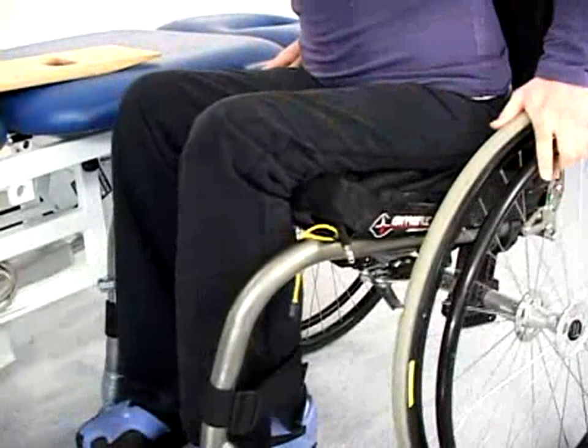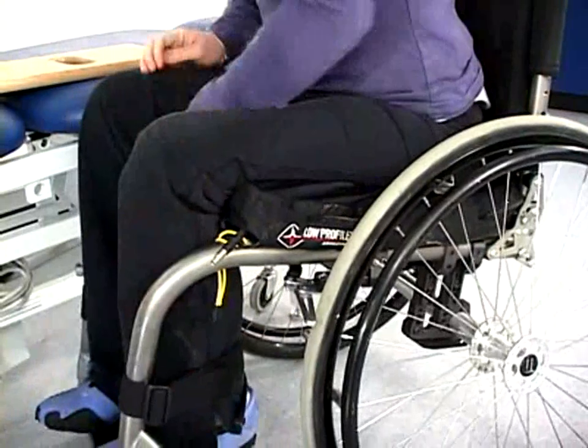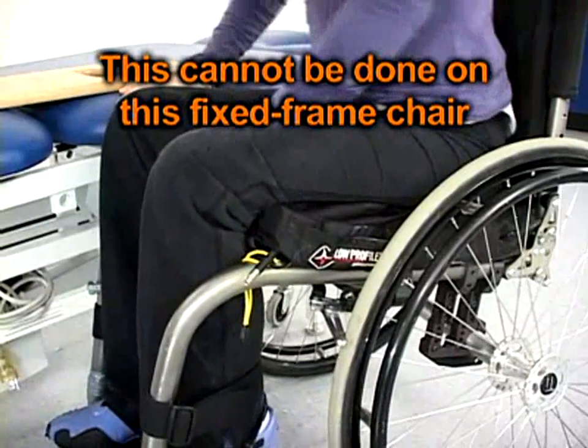To perform the sliding board transfer, the wheelchair needs to be positioned parallel or at a slight angle to the treatment table. The wheelchair is then locked. The patient's feet are removed from the footrests, the footplates are raised, and the footrests are removed from the wheelchair when possible.